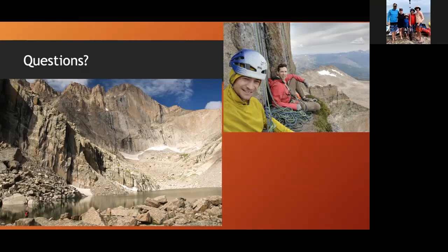Bobby, great talk. This is Brendan Sullivan. Just wanted to mention that you mentioned it with the aortic insufficiency. I think also just a quick look at the mitral valve and tricuspid valve can help a lot, especially if you see a hyperdynamic ventricle but it doesn't totally fit your picture. Sometimes the cause could be severe mitral regurgitation, or again, a hyperdynamic right ventricle with a dilated IVC could be a tricuspid valve problem. Not very common, but not uncommon in the CTICU or the cardiac surgery patient population.